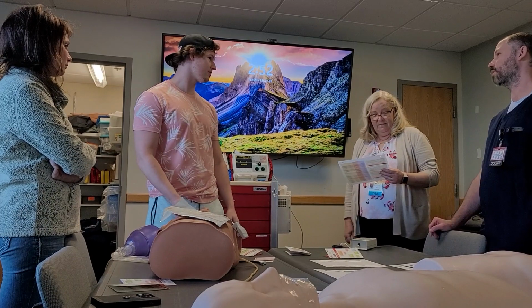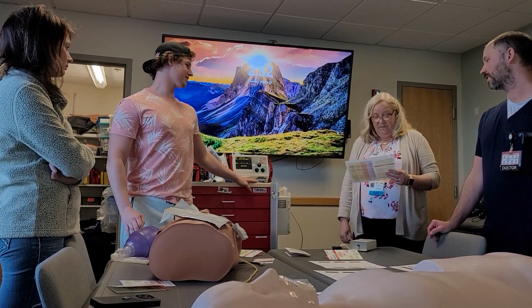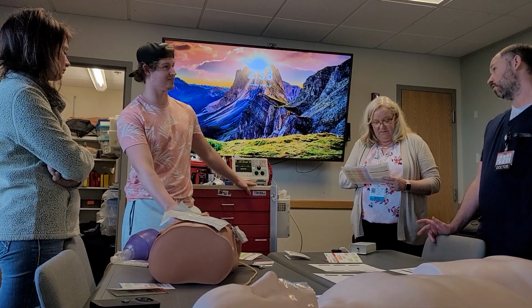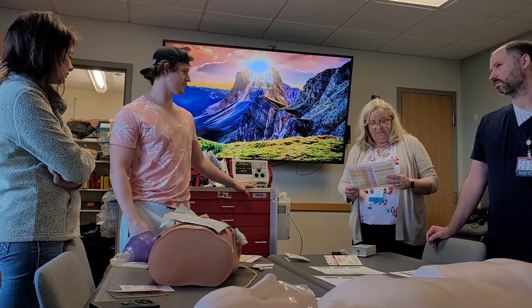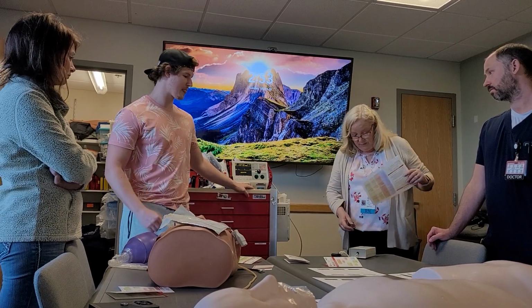What rhythm do you have? Bradycardia going on right now. Sinus brady. Do we have a pulse? You have a pulse. We had 70 over palp, so there's gotta be a pulse there. Okay. EKG shows a second degree type 1 AV block.